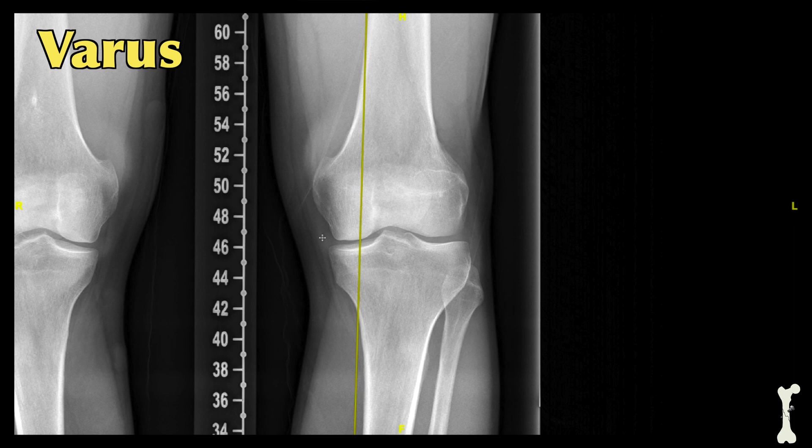Compared to the neutral alignment which passed through the middle of the knee joint, the mechanical axis of this extremity passes through the inner side of the knee joint — the medial compartment of the knee.